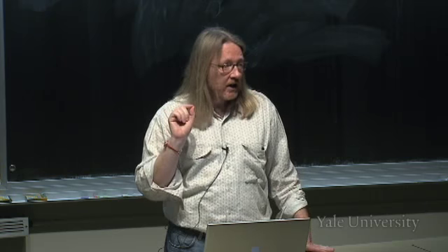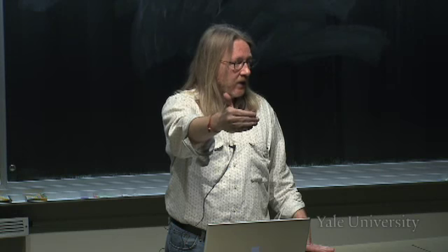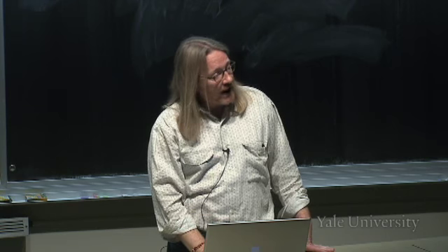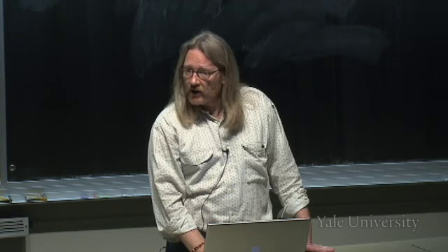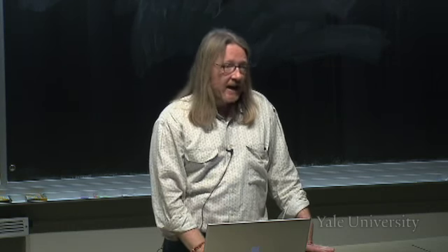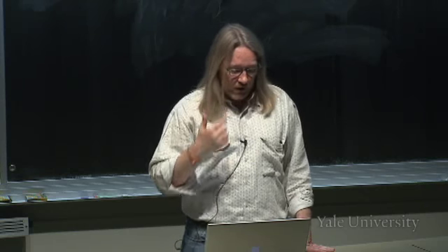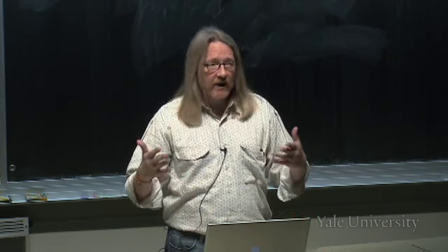If I know the speed of sound and I know how long it took for an echo to return, I can calculate how far away the object was that created the echo. So ultrasound works by sending out sound waves that bounce back, are received, and the machine calculates how long it took for this echo to go out and come back, and then it knows there must have been some kind of an object at that distance away. Does it make sense? So ultrasound creates echo time maps and calculates depths from that.